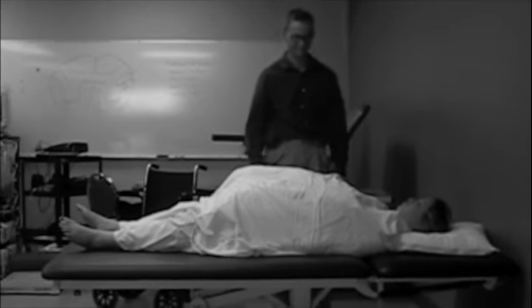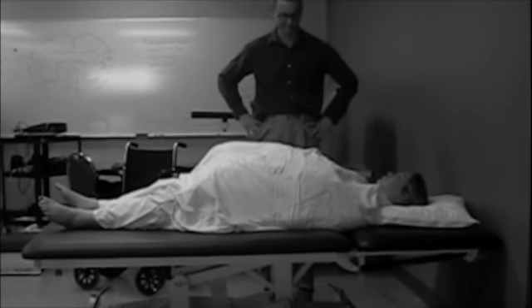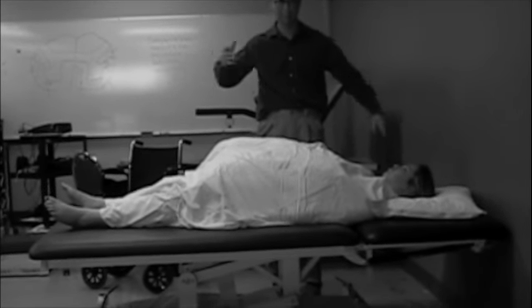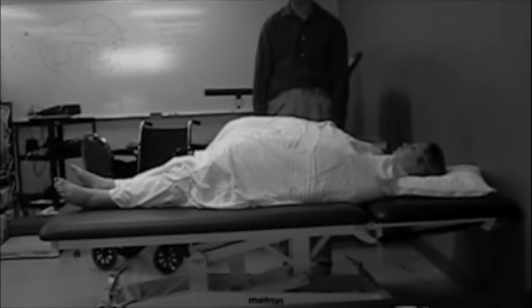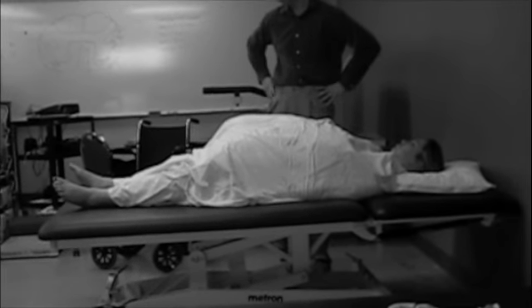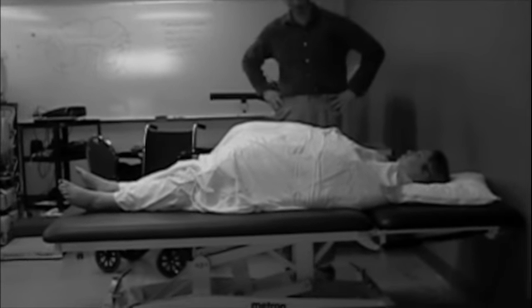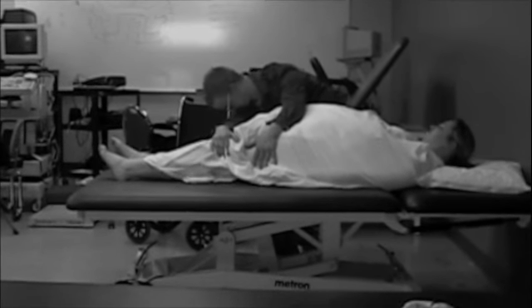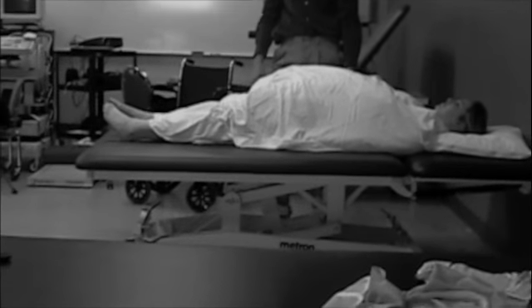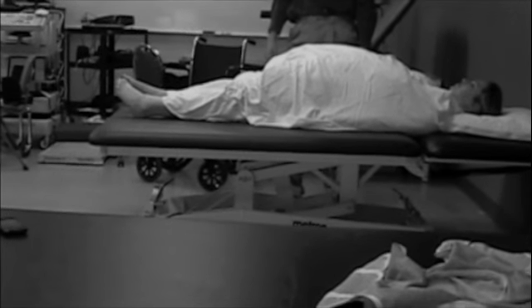My, my. That's quite a large patient, wouldn't you say, Mr. Pomperbottom? How on God's green earth are you going to get her from this table to that wheelchair? No, no, Mr. Pomperbottom. You'll strain your milk trying to do that yourself.